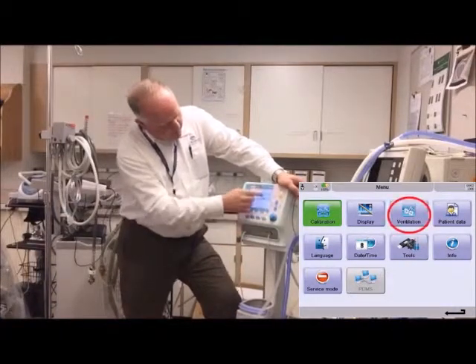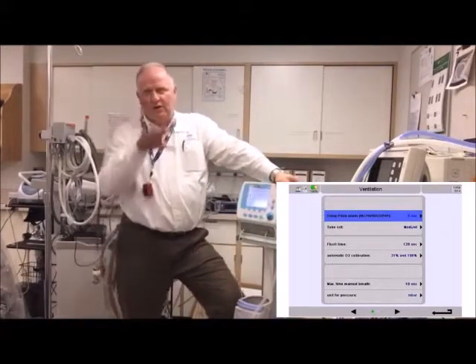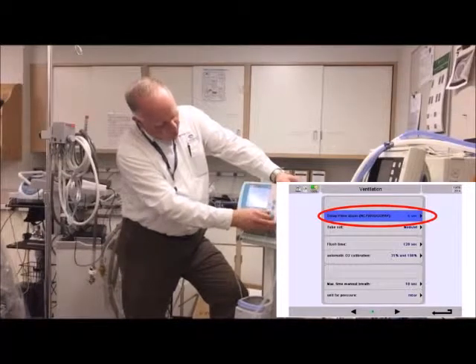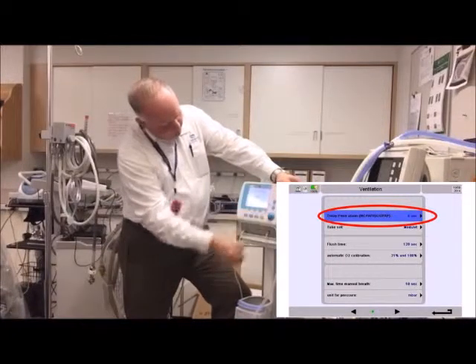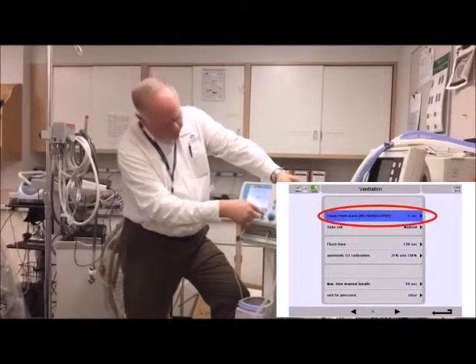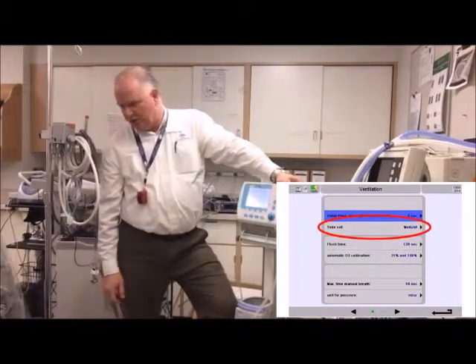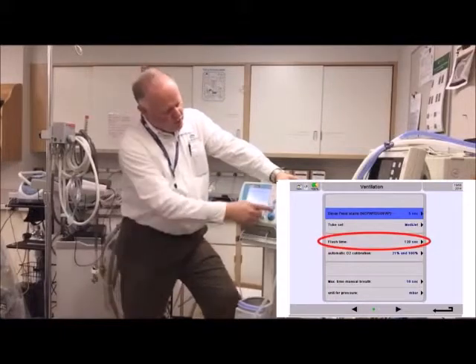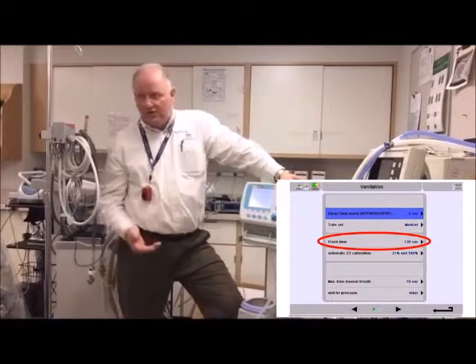The next sub-menu you'll probably want: first, how long will it wait on a low pressure before alarming — right now it's set for five seconds, but you can put it down to one or up to ten. Down here is where you change which circuit you're using — for Instant Flow, confirm it's set up correctly. Oxygen flush time: when you push the flush, how long before it times out. You can set it to 30 seconds if you don't want someone forgetting to turn it off manually.